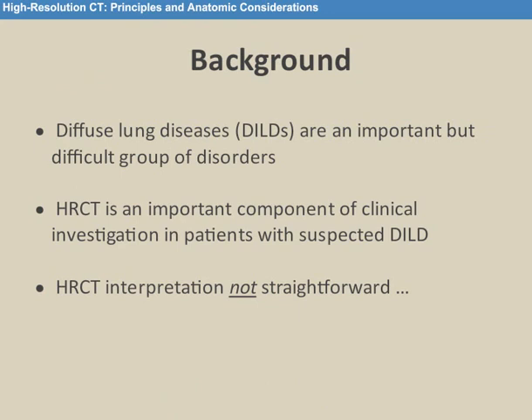Now, there is no doubt, as I think you've gathered, probably from your own practices and also from what you've heard in the previous two excellent lectures, that HRCT really is sitting there in the center of the diagnostic process. But that diagnostic process is really not straightforward. Now let's put that into some kind of context. Why is it so difficult?